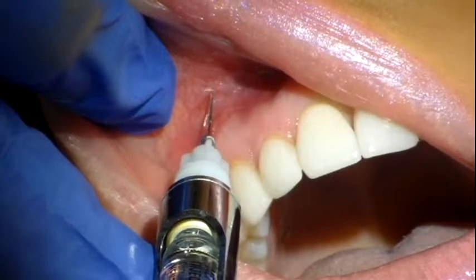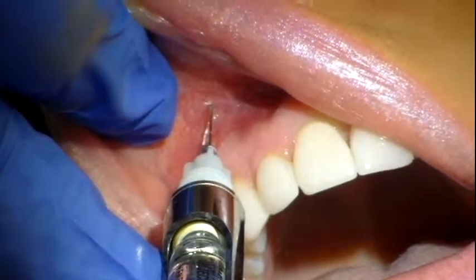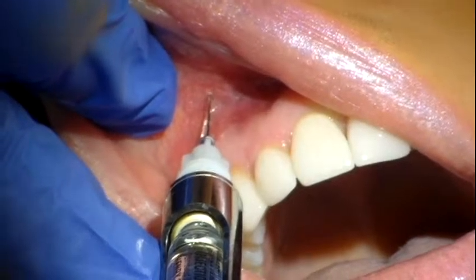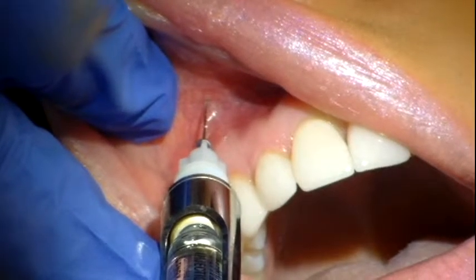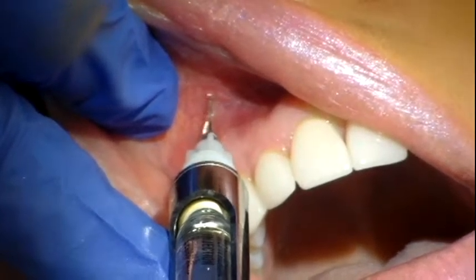I'm going to aspirate. It's negative. I'm going to deposit just a few drops. I'm going to wait 5 seconds. And now I'm going to begin depositing. And I'm going to withdraw.